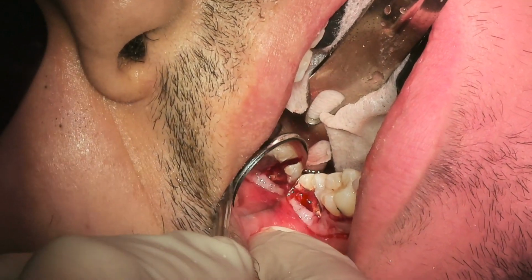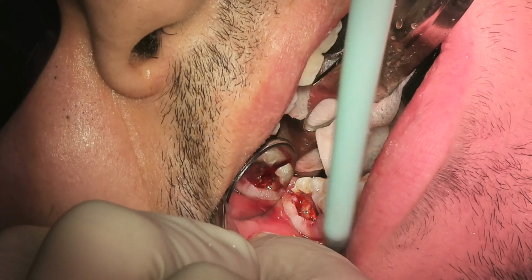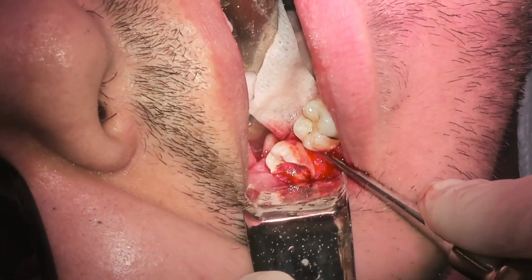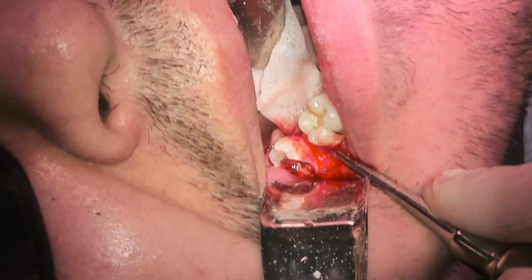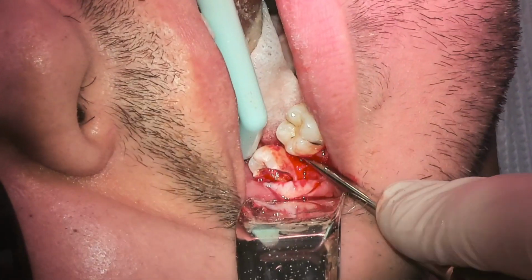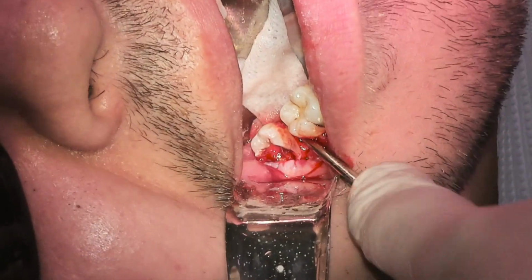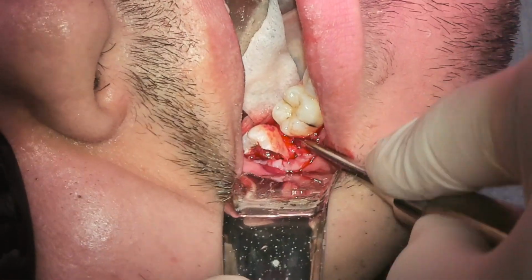So I went ahead and sectioned the tooth already. I could show you guys videos of how I section teeth later on if that's what you'd like. So here we are, starting to elevate off of the bone, not the adjacent tooth. I want to stay away from that number 30. And then we go ahead and start dislodging the tooth, as so. Making sure you're doing nice, slow, controlled movements here.